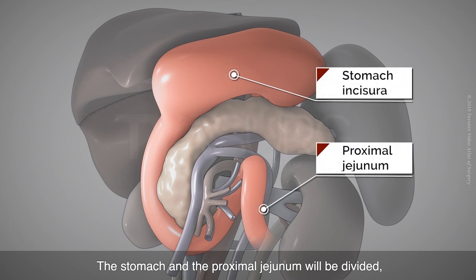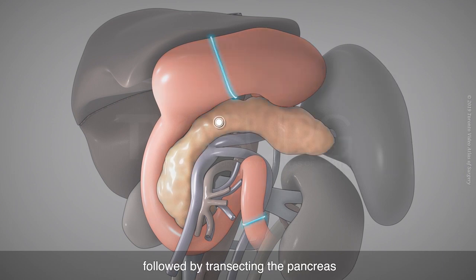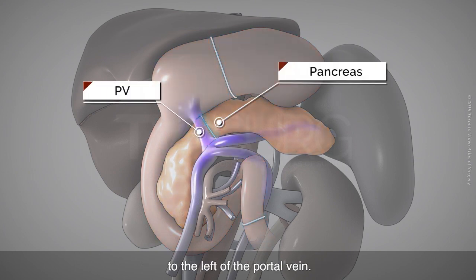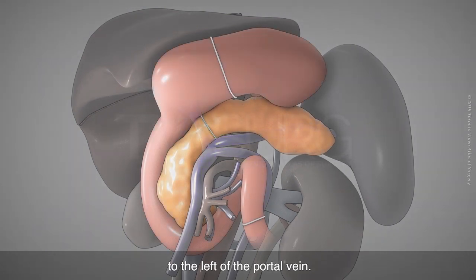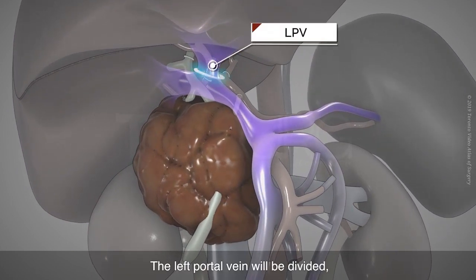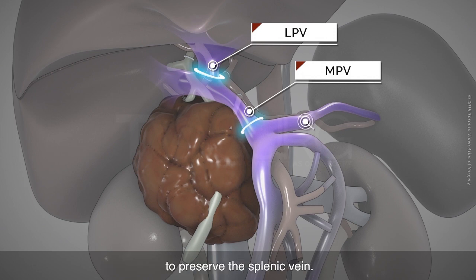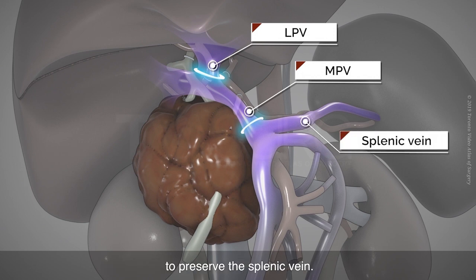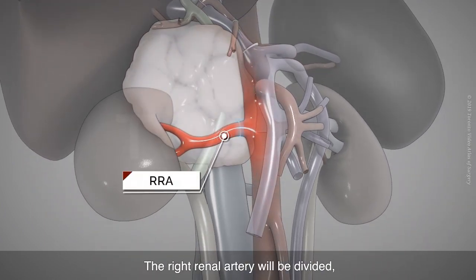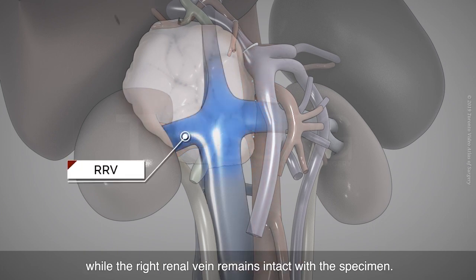The stomach and the proximal jejunum will be divided, followed by transecting the pancreas to the left of the portal vein. The left portal vein will be divided, and the main portal vein will be divided at a location to preserve the splenic vein. The right renal artery will be divided, while the right renal vein remains intact with the specimen.